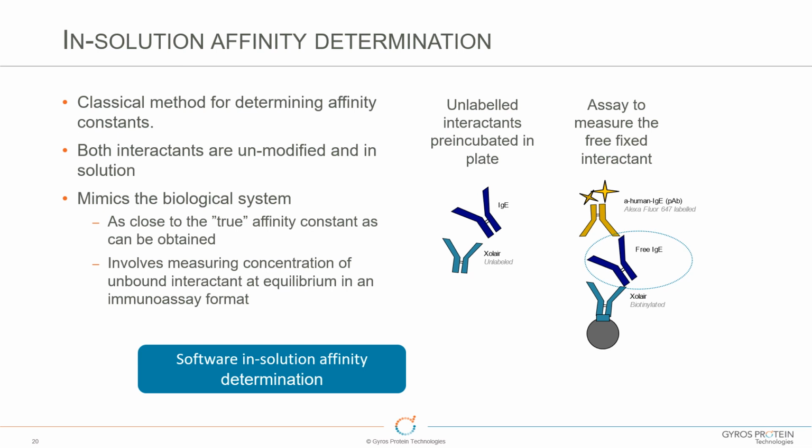So it's more reflective of the biological situation, and you're also not labeling the actual interactant, so they're allowed to react in solution, so there's no modification. So it should be more reflective of the biological system.